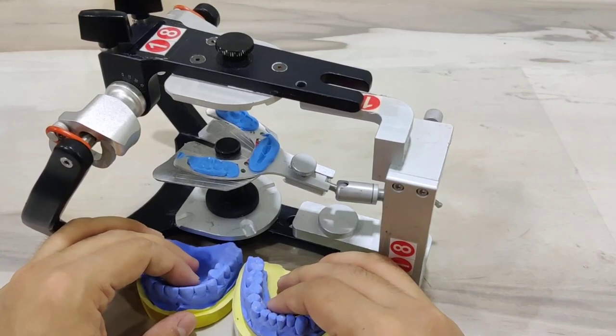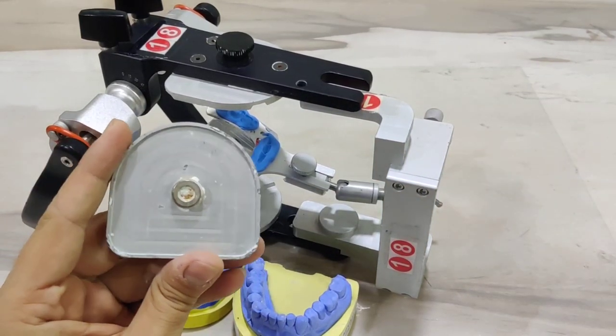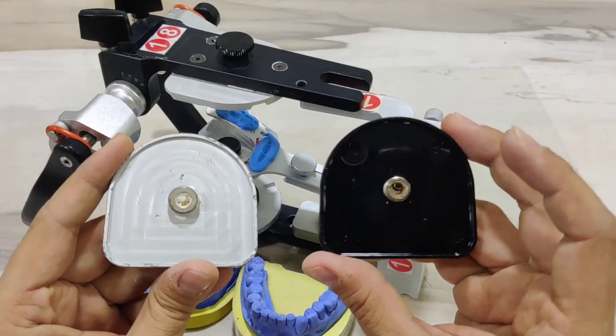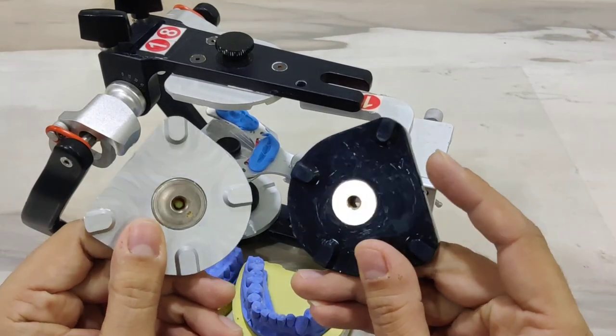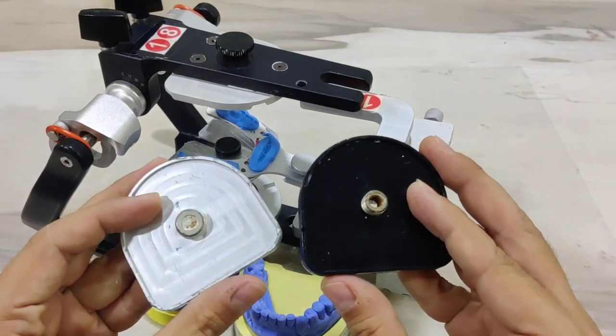Before we proceed with the actual mounting, let us look at the mounting plates available with this system. On the left you see the metal mounting plate, whilst on the right in black you see the plastic mounting plates. Both of these are magnetic and they snap fit onto the maxillary and the mandibular member.